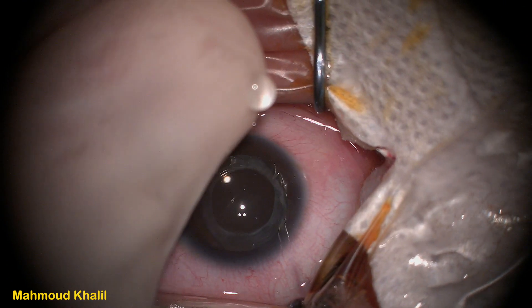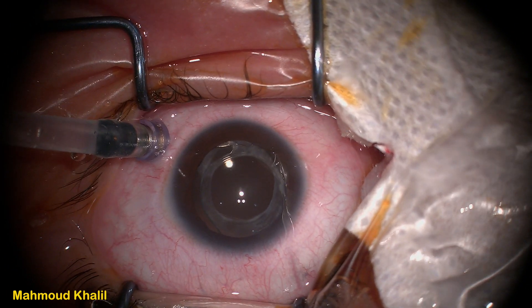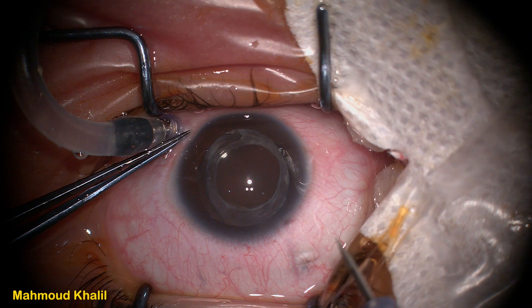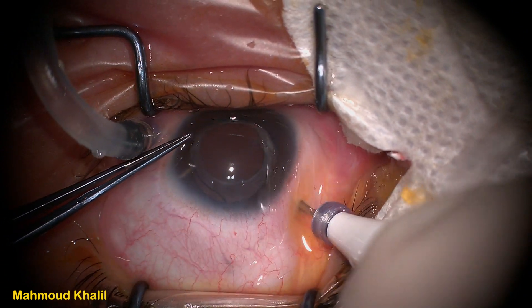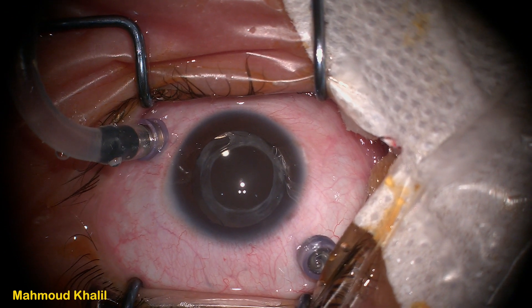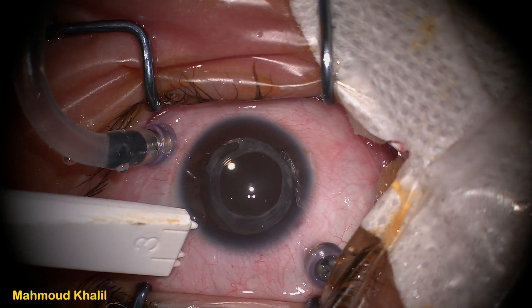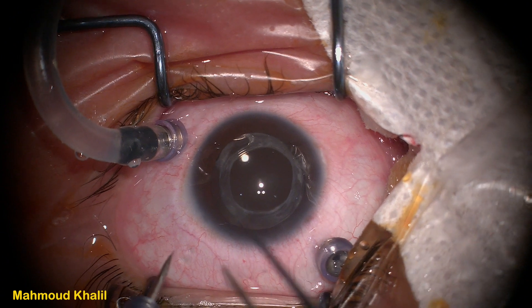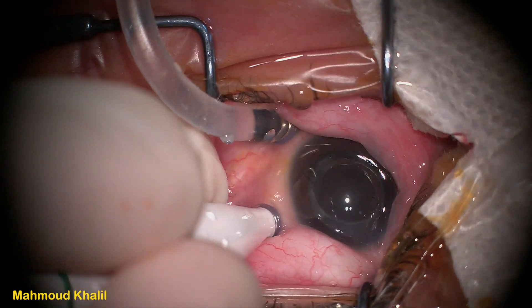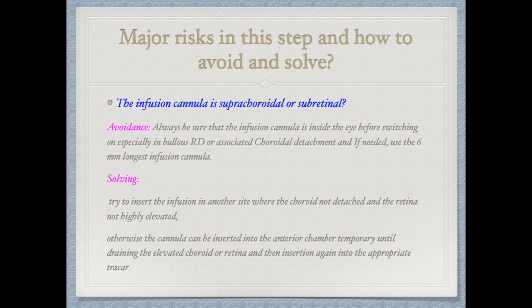We check the infusion cannula, open it to get rid of air, and confirm it is functioning. Then we place the infusion cannula inside the trocar while the infusion is off, and check the infusion cannula position inside the eye — either by light from outside or by placing the light probe inside the trocar to visualize it inside the eye. After switching on the infusion cannula, we place the second trocar. Trocars are placed in a slanting position to create a valve-like incision inside the sclera, helping it close postoperatively. The other two trocars are placed at ten and two o'clock.